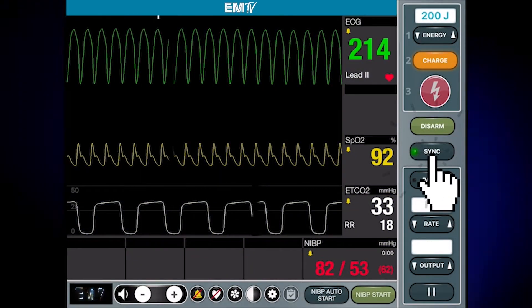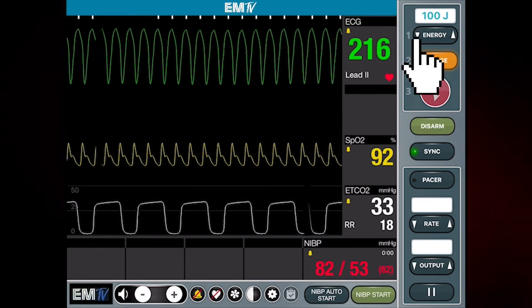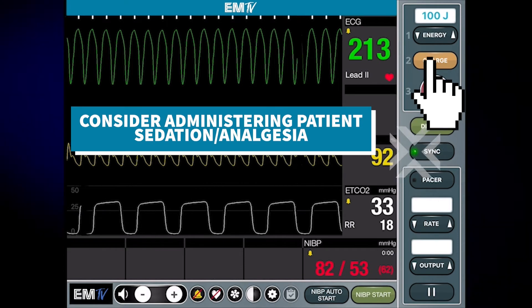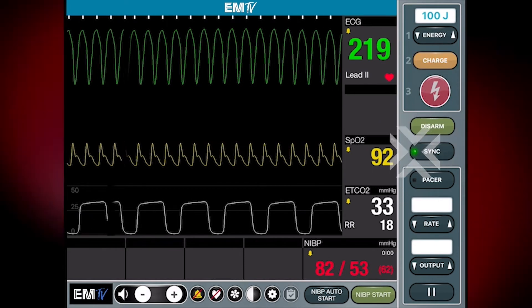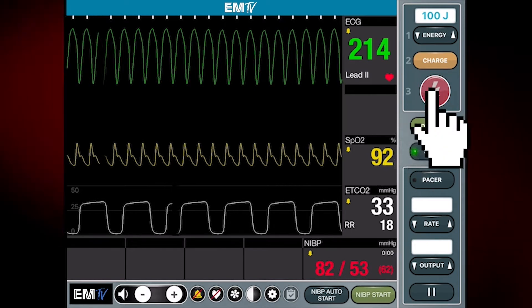The first thing I'll do is press the sync button. I'll then select an appropriate energy level. I'll press charge, making sure the sync button stays lit. Once fully charged, I'll press and hold the shock button to deliver the energy.